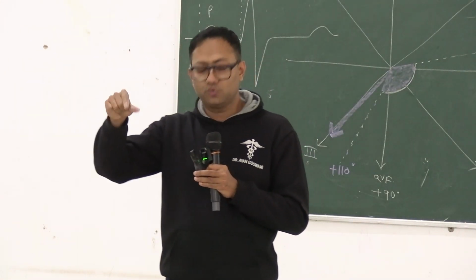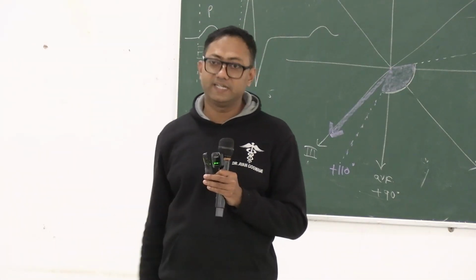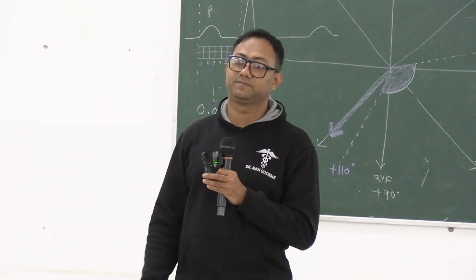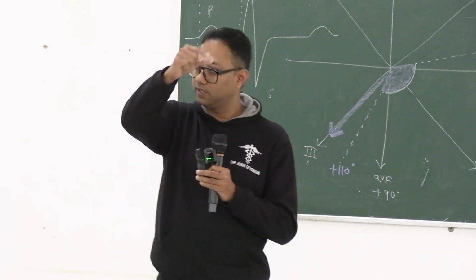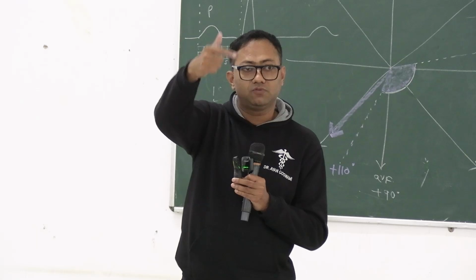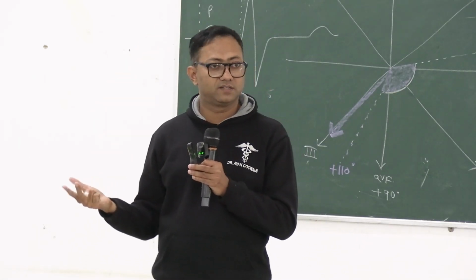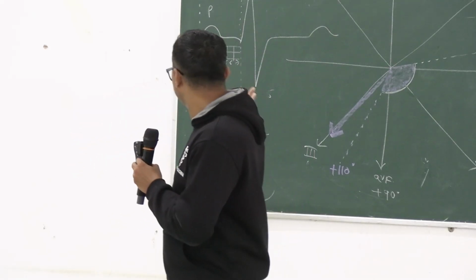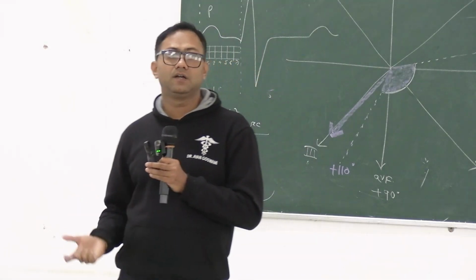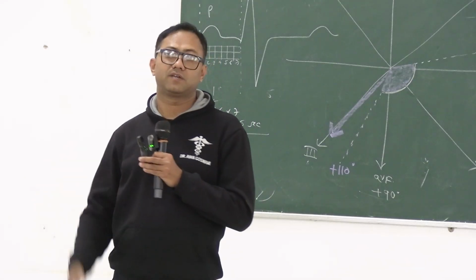And it travels through the internodal tracts between the SA node and the AV node, and enters into the ventricle. So this is the time it takes from where the action potential is generated to travel from the atria to the ventricle. Getting my point? This is the time for the PR interval. So we check the PR interval and we get an idea of how fast your atrial depolarization travels into the ventricle.